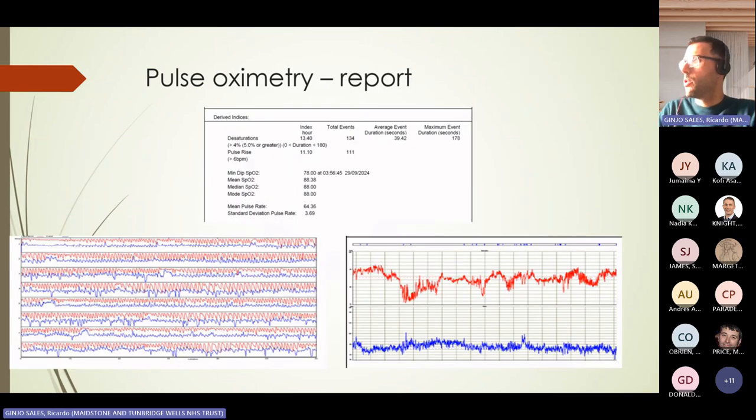This is the template report. So despite only one or two signals, it's giving us quite a good indication about oxygenation, pulse as well, median SpO2, how the pulse looks like, if you suspect hypoventilation, hypoxemia, and then you can make clinical decisions based on these results.